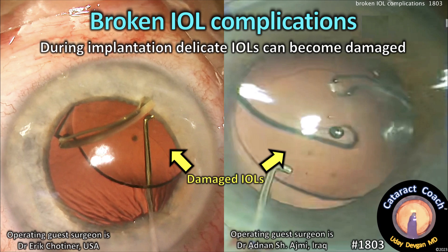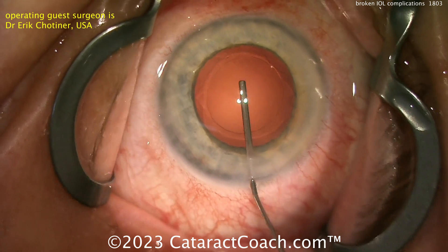CataractCoach.com — broken IOL complications. Have you had this happen to you? Broken lenses, damaged optics, damaged haptics.